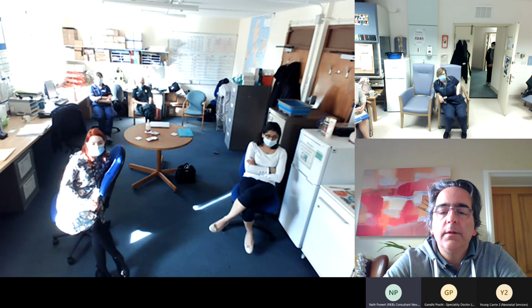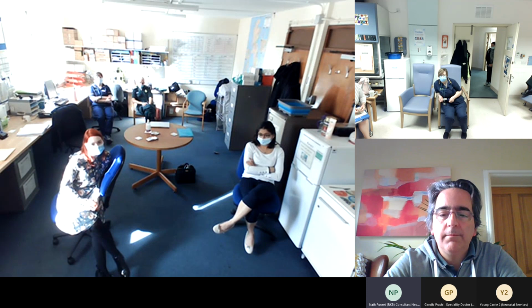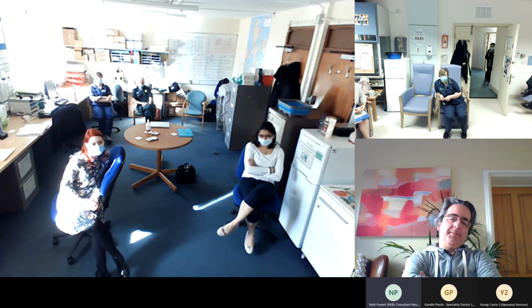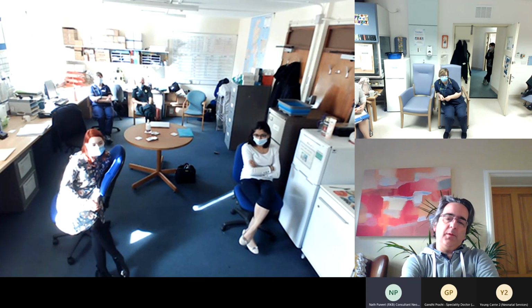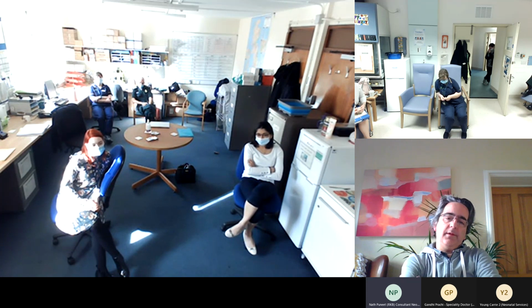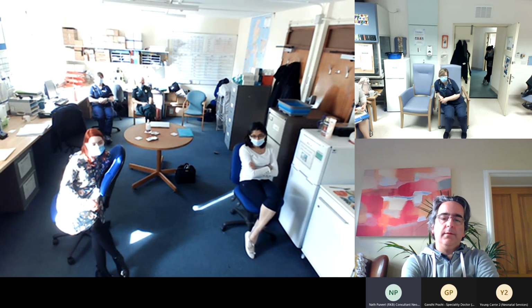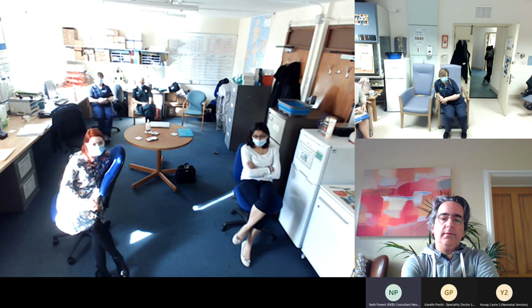I think Doppler's all good and a good thought. Not really helpful in the middle of the night in a level 1 unit in a tiny baby. So I think the important thing here to remember is when we take over the baby and we look at the line positions, we should be absolutely happy with the lines and their tips with where they are. I'm not saying they have to be into the millimeters perfection of where they should be, but at least we should be happy that we're using UAC as a UAC and a UVC as a UVC at least. And the lines are not in the heart.